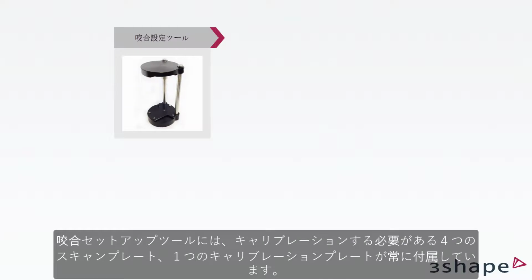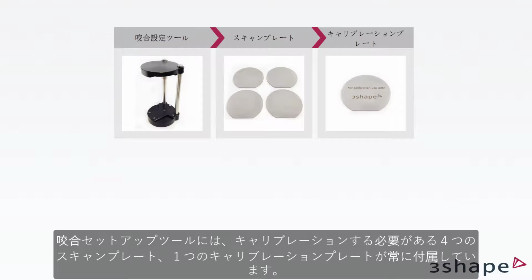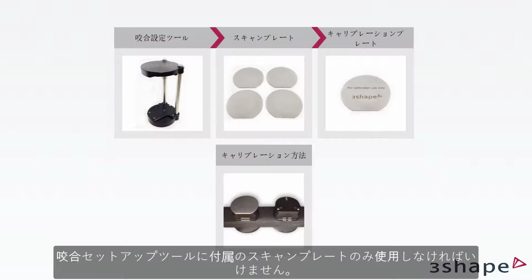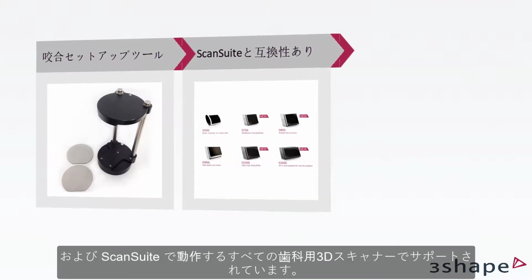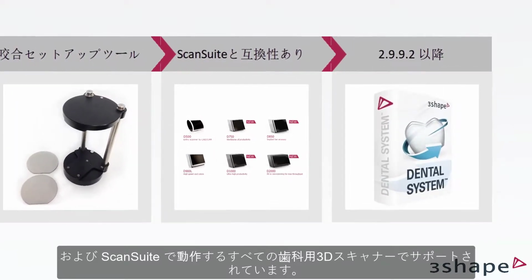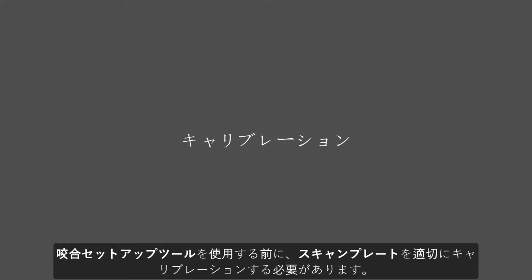The Occlusion Setup tool is always supplied with 4 interface plates and 1 calibration interface plate, which need to be calibrated in the scanner. Only interface plates supplied with the Occlusion Setup tool can be used with it. None of the other interface plates will fit that tool. The Occlusion Setup tool can be used with all dental scanners working with Scan Suite and is supported by Dental System 2.9.9.2 or newer versions.